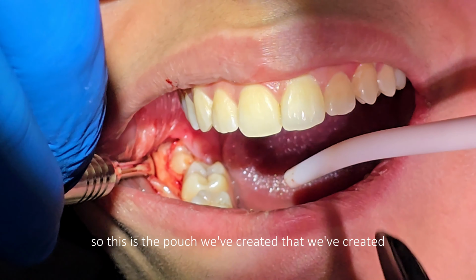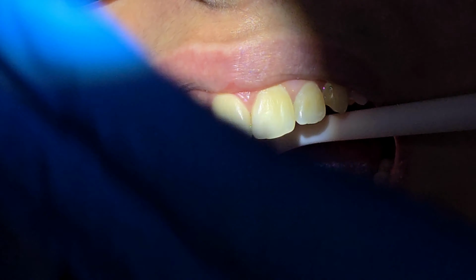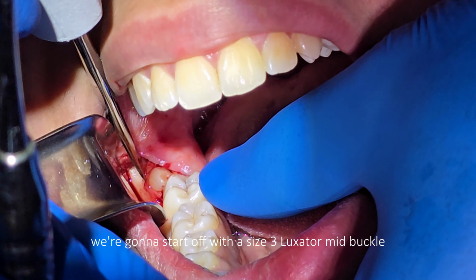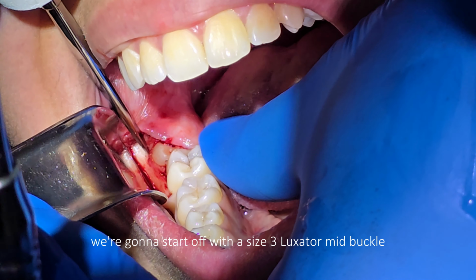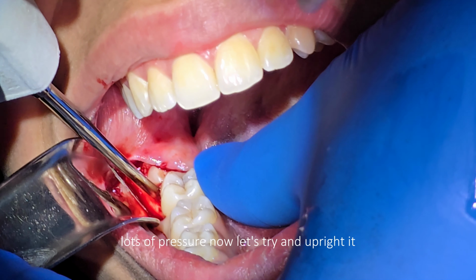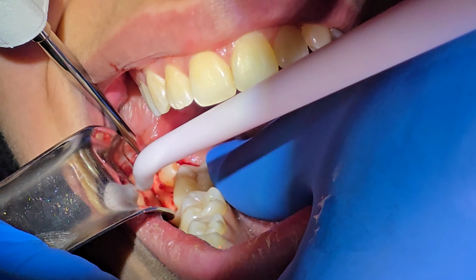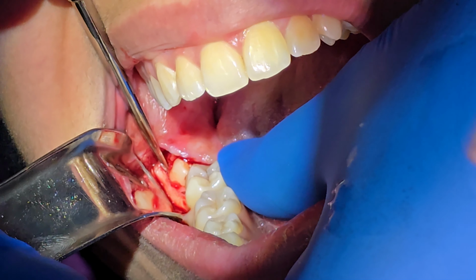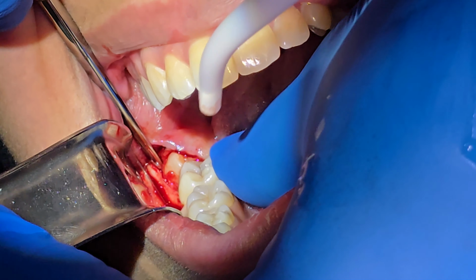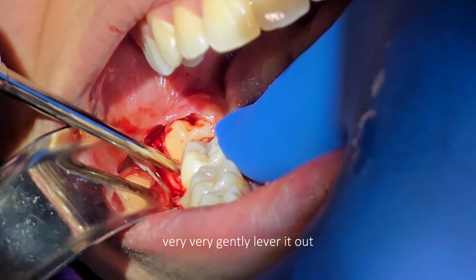So into this pouch that we've created, we can pop the Minnesota retractor into the space. So we know there's conical roots. I'm going to start off with a size 3 luxator mid-buccal, apical pressure, forcing it down the long axis. Lots of pressure now. Try and upright it. Pushing against the buccal bone. Very, very gently lever it out.